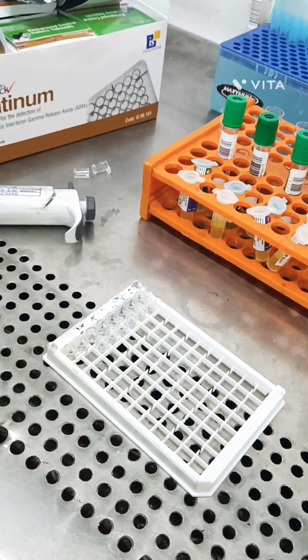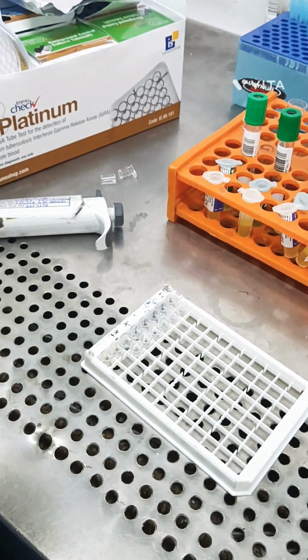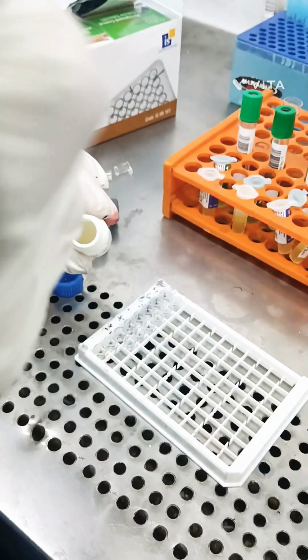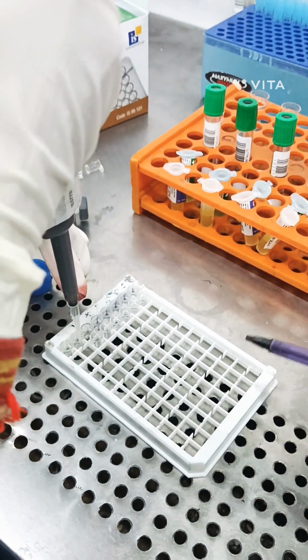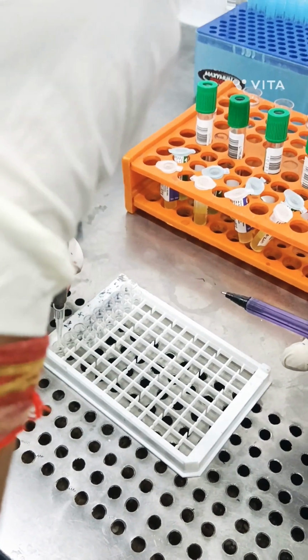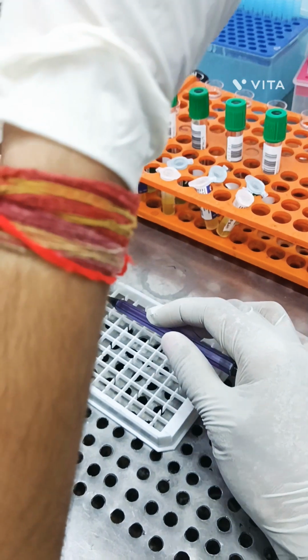Sample collection is done in heparin vials, and we have to incubate at 37 degrees for 24 hours in N or T vials. In the patient sample wells, take sample dilution buffer first, and we have 4 samples, so accordingly we have to transfer sample dilution buffer only in patient sample wells.